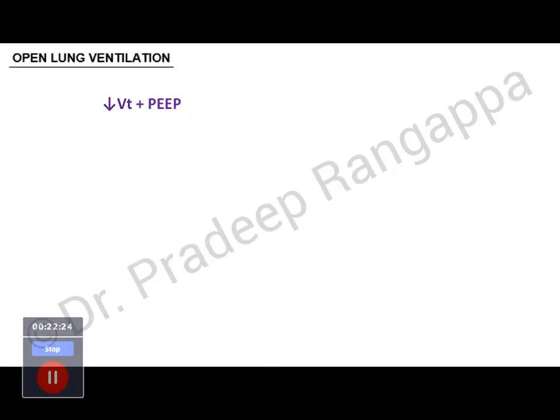So we'll talk about it later. So we spoke about low tidal volume. We spoke about permissive hypercapnia. Then we'll talk about open lung ventilation. Open lung ventilation is also the essence of ARDS ventilation. What it simply means is, low tidal volume we spoke about, plus adding PEEP. It's not only PEEP, optimizing this PEEP is what we call open lung ventilation.